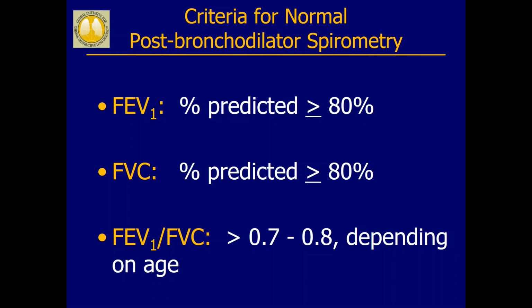There is something called the NHANES, and I'm not going to go into what it stands for, but the NHANES survey of healthy individuals gives you what a normal range of percentages are for a lot of different metrics, including FEV1 for a given population. And so you would have a normal range for FEV1 for a certain ethnicity, age, and sex. It depends on your spirometry if that's how it's set up.